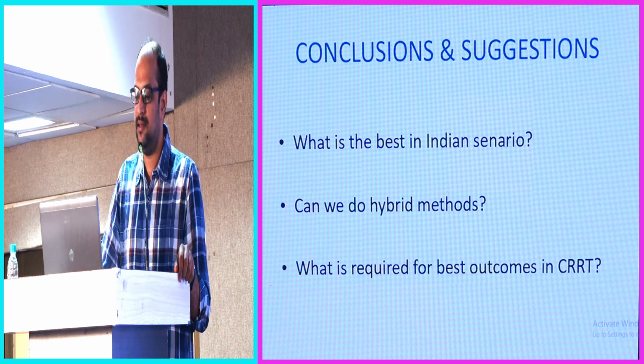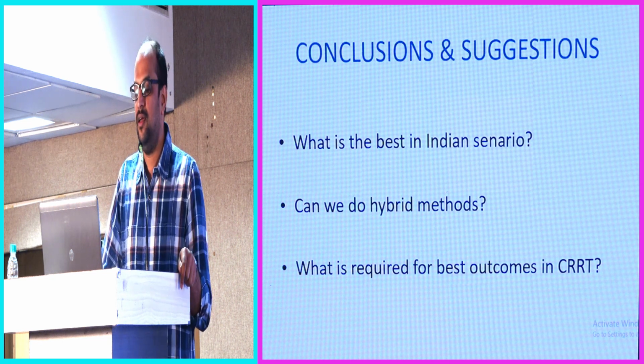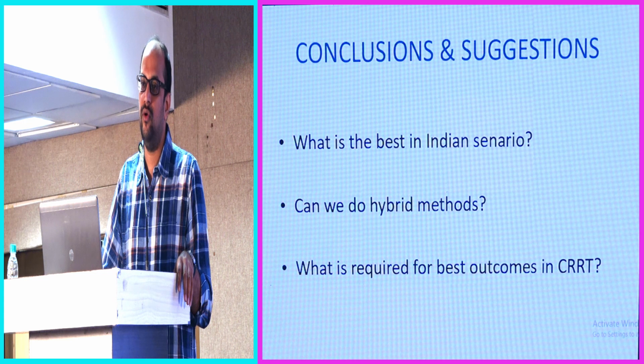Based upon the clinical status of the patient, we can use heparin, but if we are in a proper setup where our technicians and everyone are trained, it's always better to go with citrate.